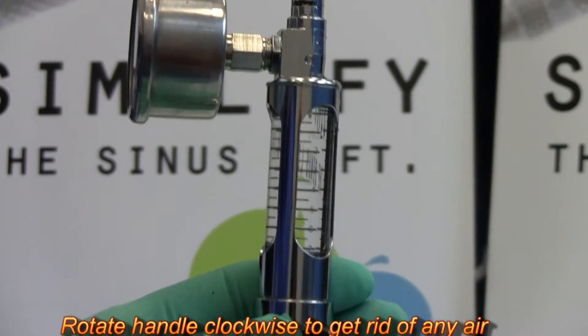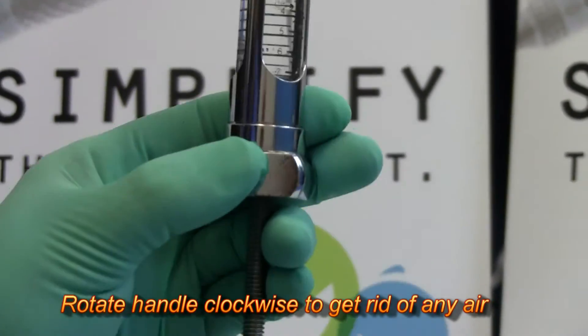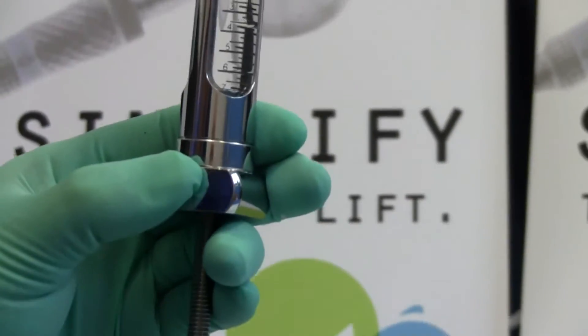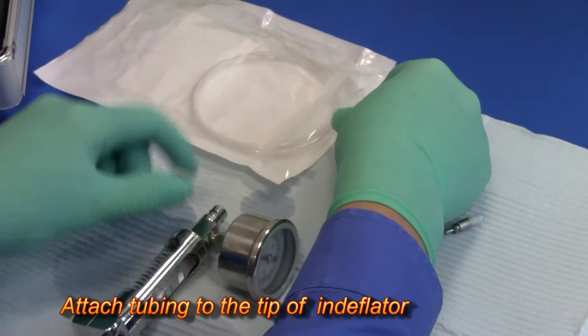Hold the indeflator perpendicular to the ground and rotate the handle clockwise to get rid of any air bubbles. Then attach the tubing to the tip of the indeflator.